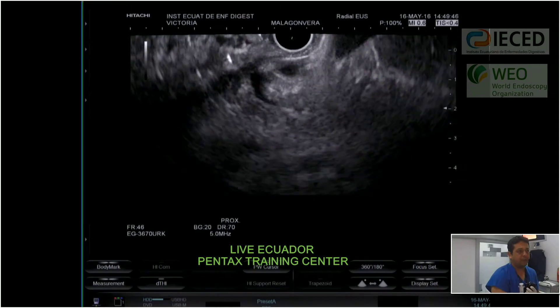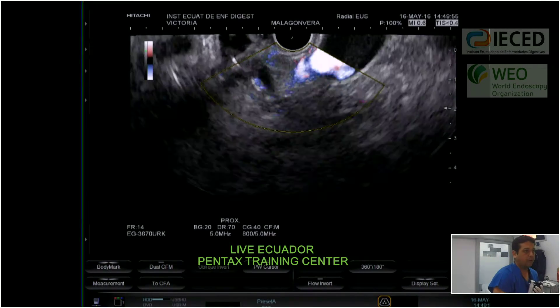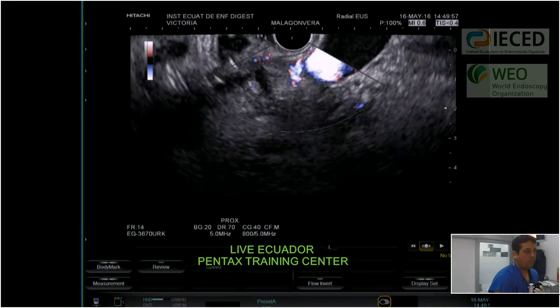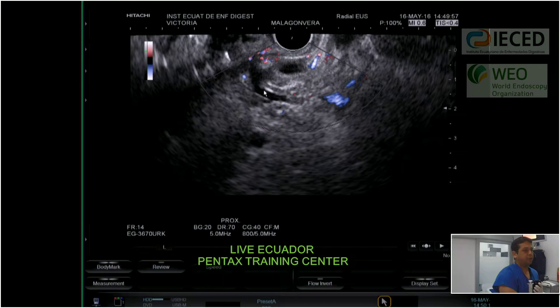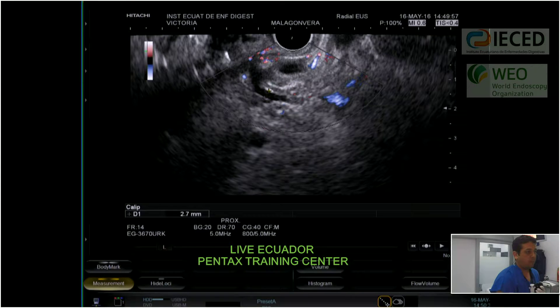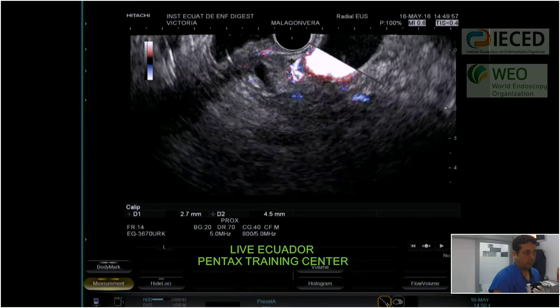We need to see if this patient doesn't have any other alteration, for example stones in the biliary tract. Here we are looking at the common biliary duct — it doesn't have any kind of lesion inside. This is the main pancreatic duct, showing some hyperechoic areas but no irregularity. The main pancreatic duct measures 2.7 millimeters, which is normal, and the common biliary duct is 4.5 millimeters, also without any alteration.